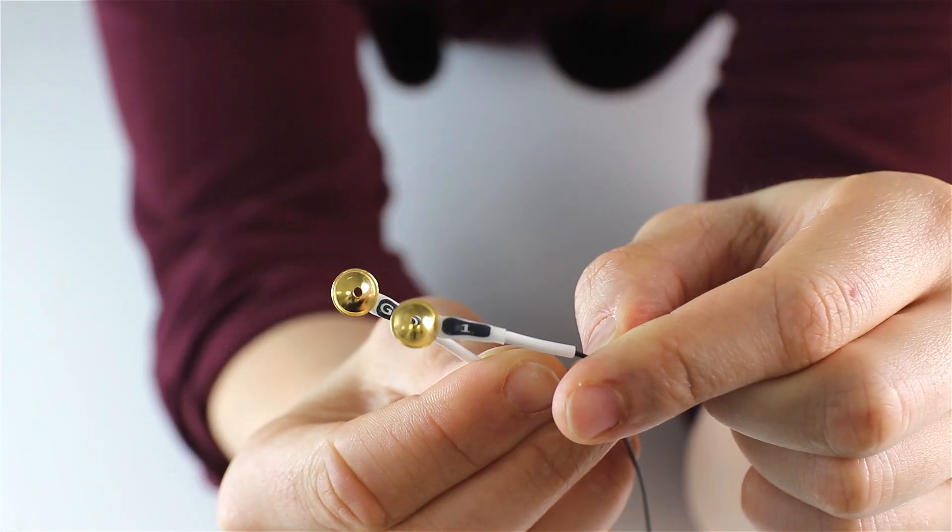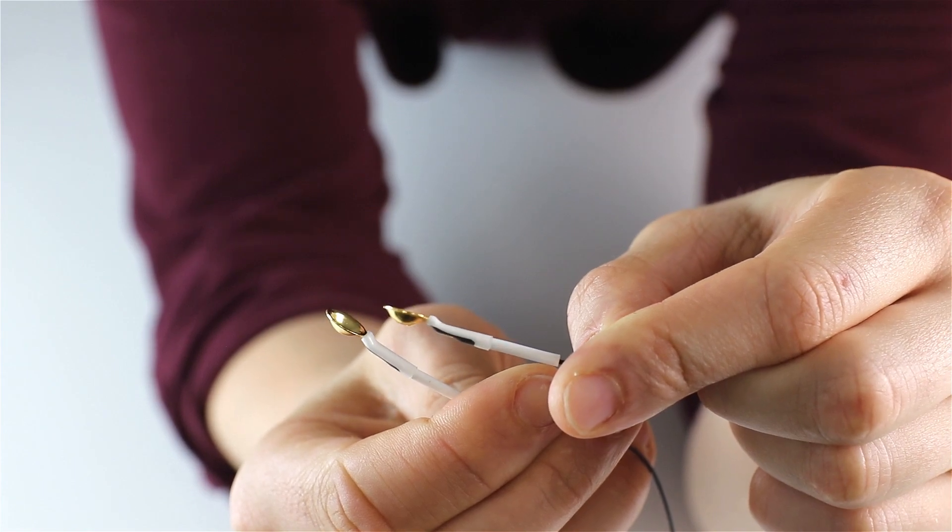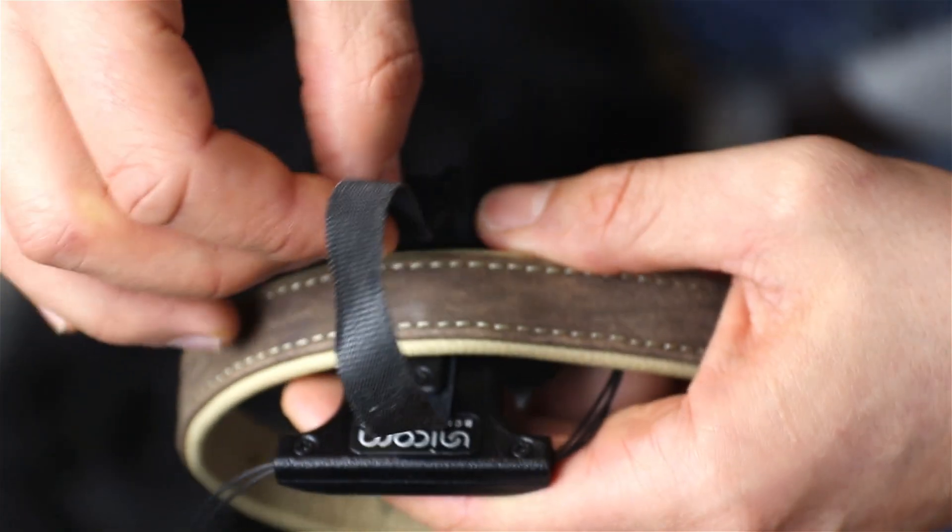Ensure that the electrode numbering is correct, with electrodes 1 to 8 and the ground electrode properly identified.